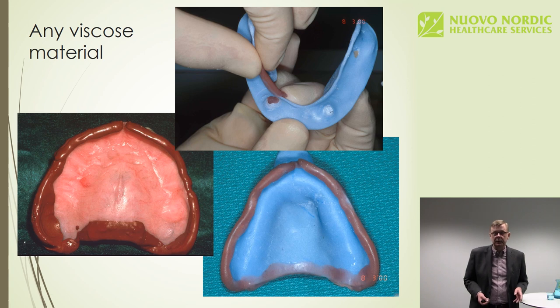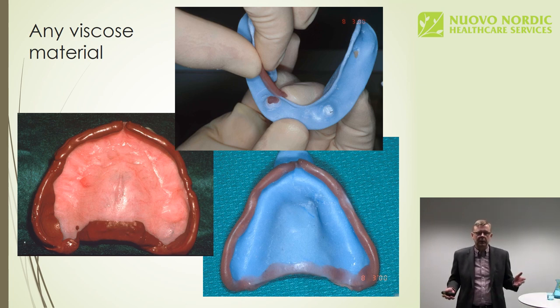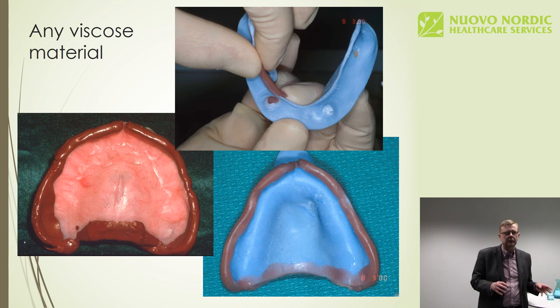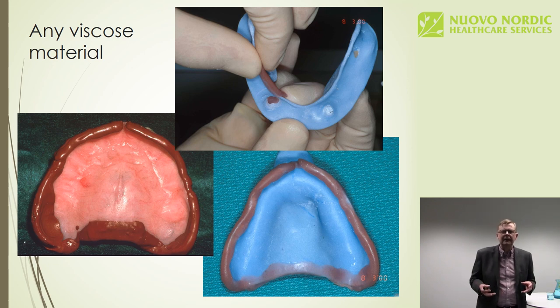However, I myself use medium body polyvinyl. You can border mold the whole tray just in one shot, and it will take 1.5-2 minutes. The important thing is that the borders won't be under or overextended. We're aiming at having a good suction cup effect.